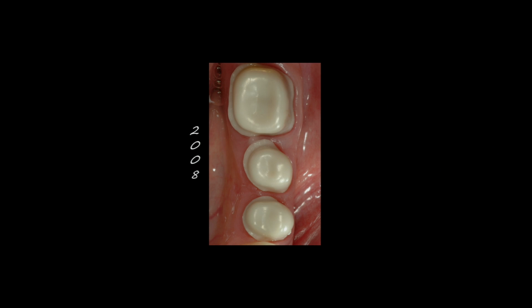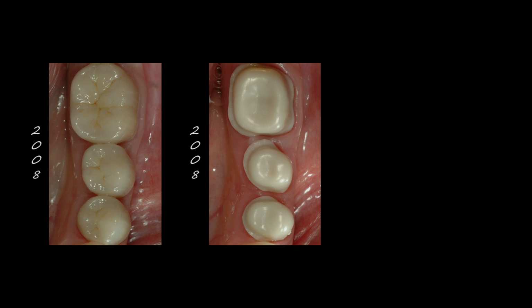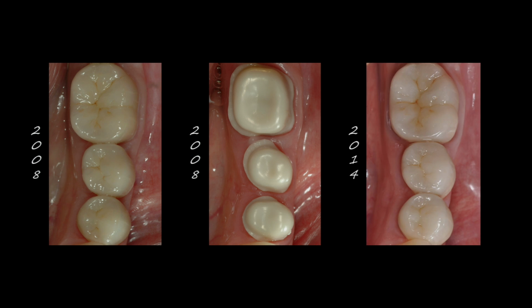So in 2008, we tried those copings, we delivered the restorations, and a few weeks ago, the patient was seen in the office and everything still looks intact. These restorations were layered with a veneering porcelain for zirconia. In this case, that veneering porcelain was pressed, which provides us with more durability, and these restorations are still doing great.